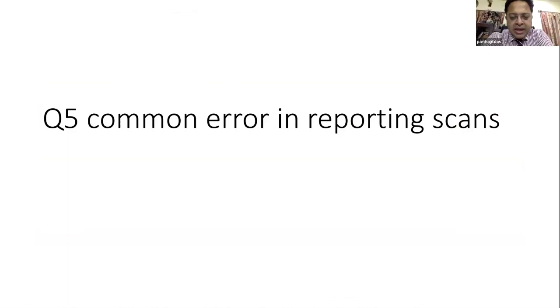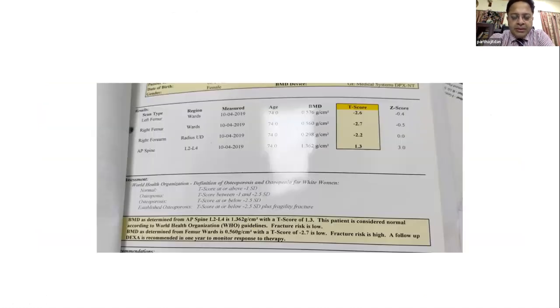Now, I think that's again very interesting. So the next thing is, what are the common errors when we report a DXA scan?